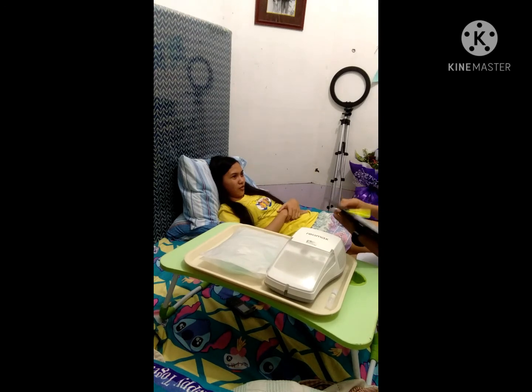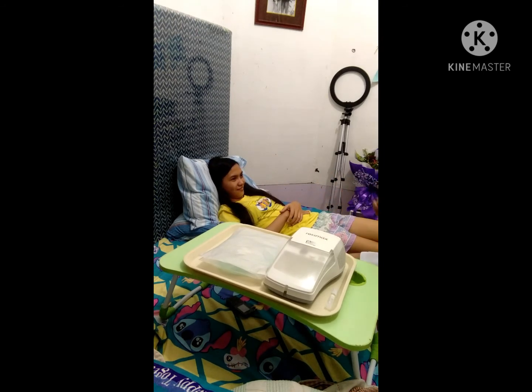Ask the patient to state his or her name or check the identification band for identification. It is important to explain the procedure to the patient to gain cooperation and allay anxiety.